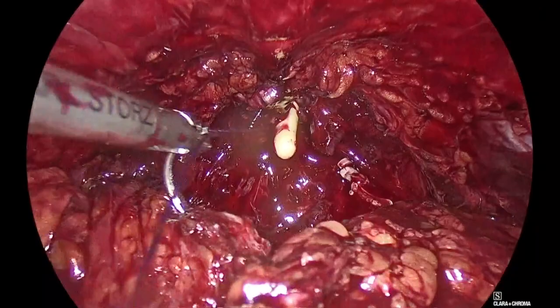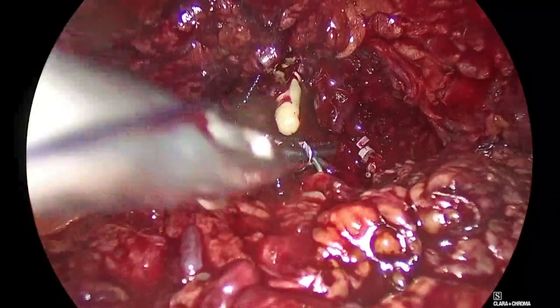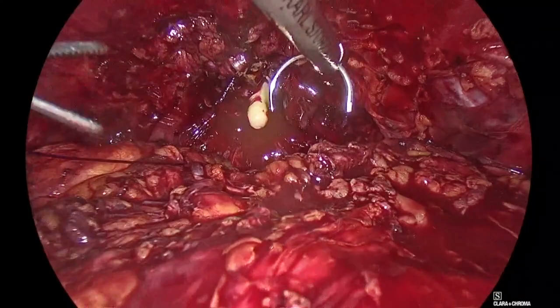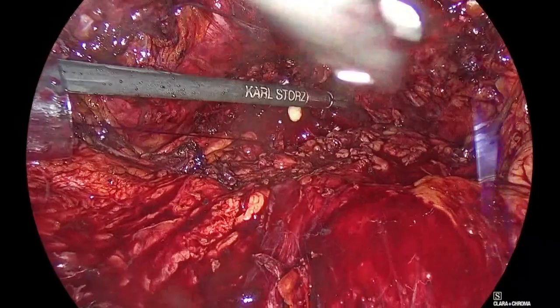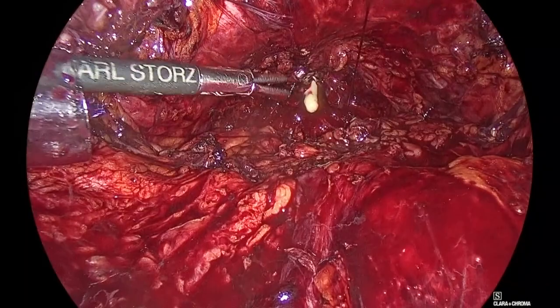When we first started this, we always used to do a cystoscopy, and only when you have previous prostate surgery. When you have previous prostate surgery, this is a standard thing in our department: we always make sure that there's a stent pre-placed on both ureters or at least one, and that the suture comes in. You see the knot that I've made?